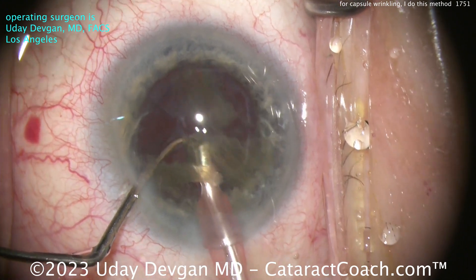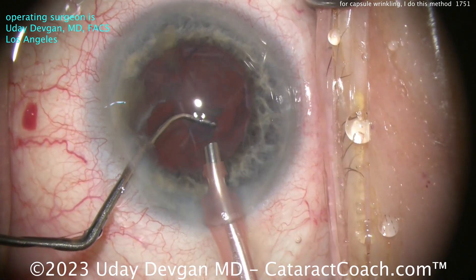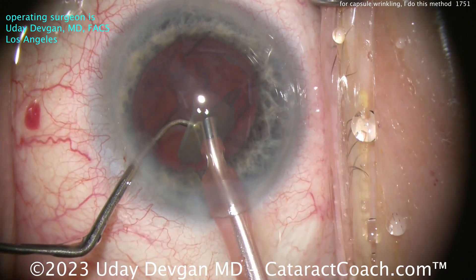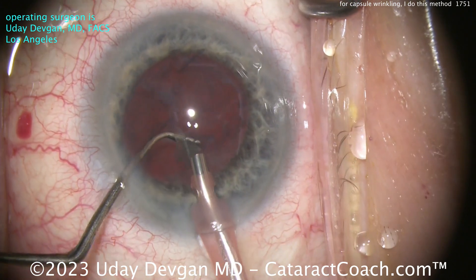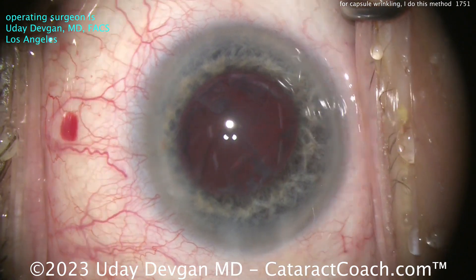There's a little separation between those pieces — taking our time, aspirating these down, nice and easy, piece by piece. Chopper in the safe position — remember that bag's already loose, I don't want any undue risks. Nucleus removed. This patient is near and dear to my heart, so I really want to deliver the best outcome.